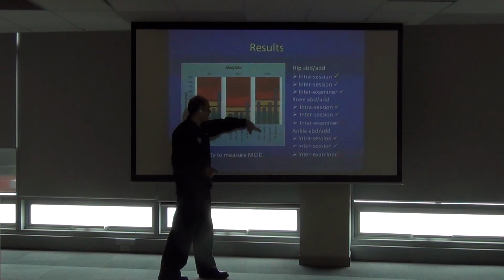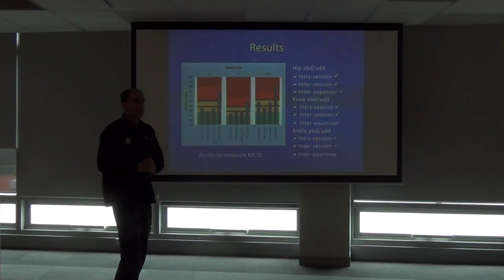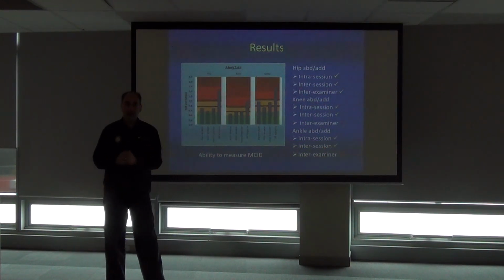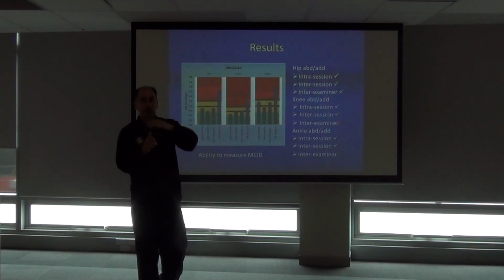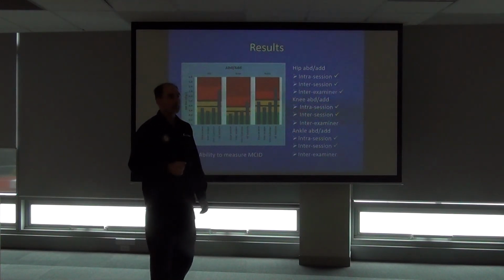Inter-session, intra-session, inter-examiner. Again, slightly high. Something to look at here with inter-examiner. What was influencing inter-examiner? Maybe the goniometer stuff at the beginning. Something to really look at. Looking back on it, it's not the ideal thing to use the goniometer like that. Maybe something we need to do there is have 2 examiners doing goniometer, one to measure, one to check.